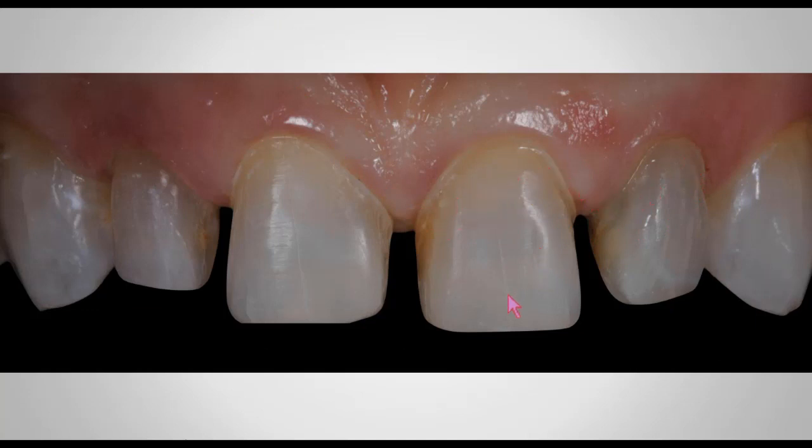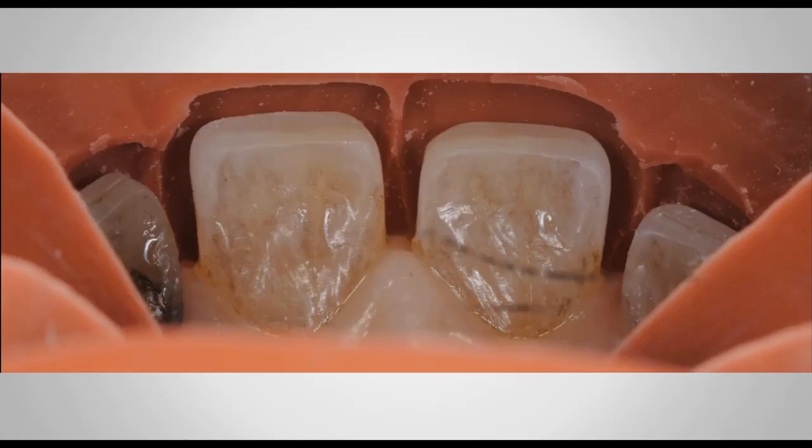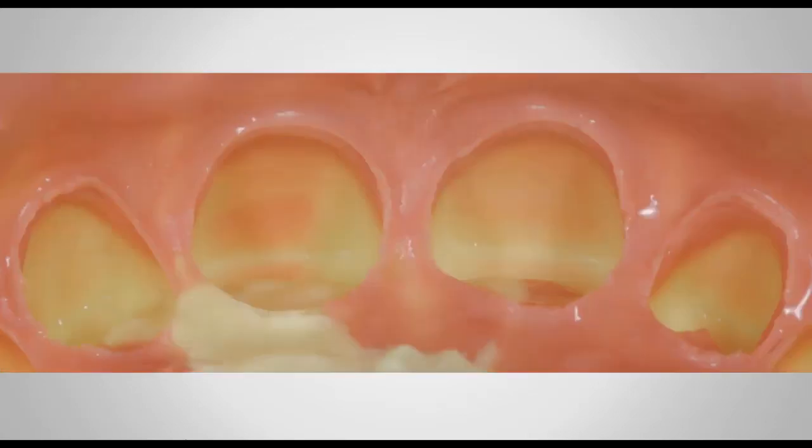All my preparations are 100% enamel, which is the best tissue to bond any type of porcelain veneer on cases like this. All enamel, very nice, smooth, round line angles, ready for my impression. And this is the guide that I fabricated on top of my wax up, just to make sure that I'm calibrating my preparation, and I can tell that I'm giving the lab enough space, because again, he's got to add. There's not a lot. I don't need to remove a lot because he has a lot of room to add the porcelain. And there's my final impression.